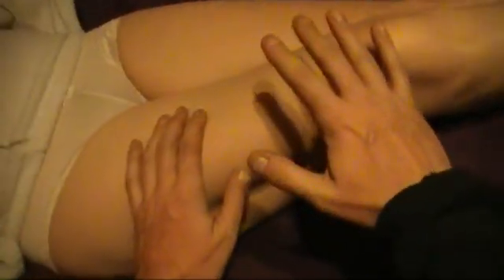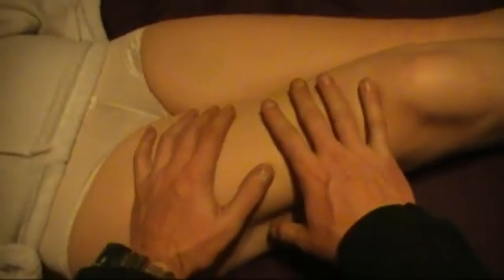The steps for controlling all bleeding: first things first, put pressure on the wound. The next thing, of course, use some sort of gauze or whatever placed on the wound, and also pressure on the wound. You see a theme here? It's always pressure on the wound. Now, we're going to skip over the pre-steps and go straight into the tourniquet application and use.